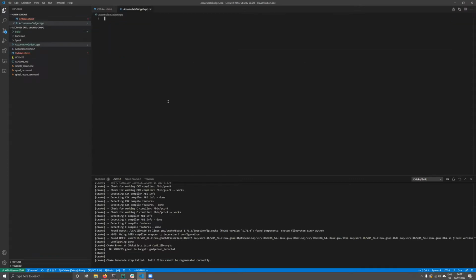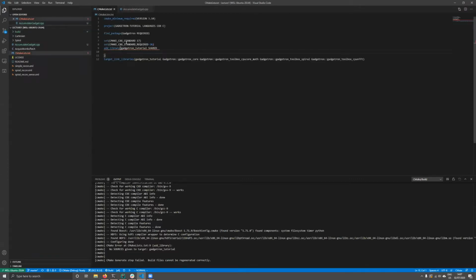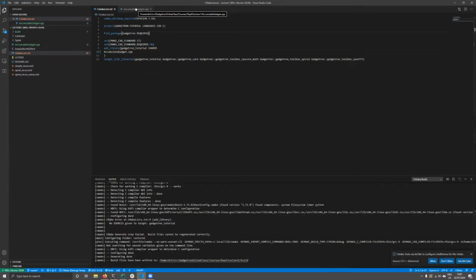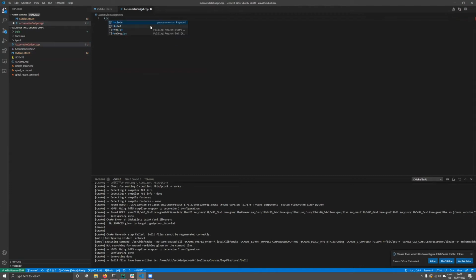So we'll start by making an accumulate gadget and add that to CMake. And now it's happier. So the first thing we need to do is include some things from Gadgetron, in particular node.h. So node.h includes everything that can sort of be inside a gadget chain, including the channel gadget, which is what we'll be implementing a lot of today.